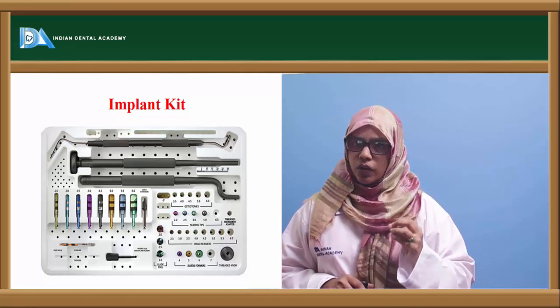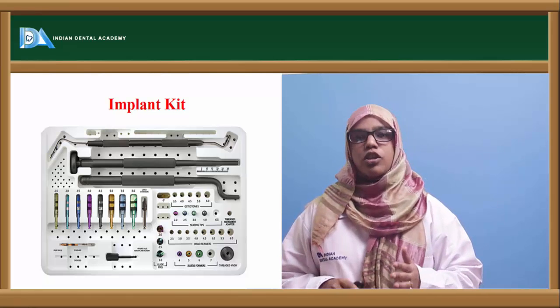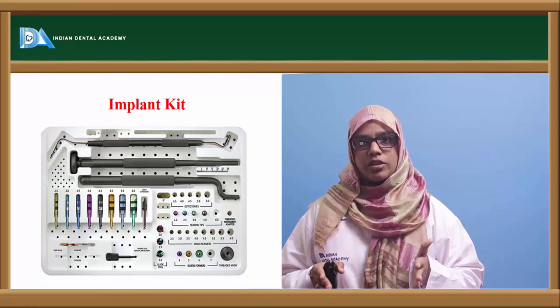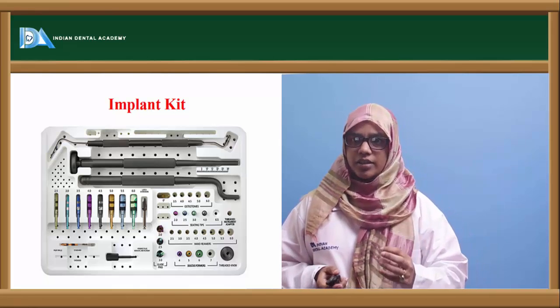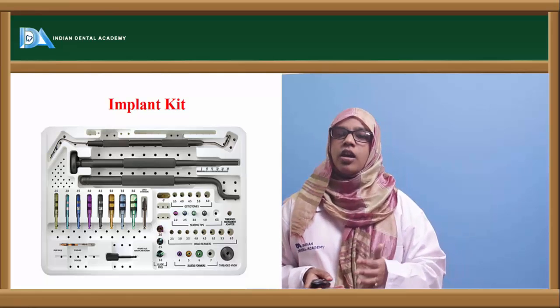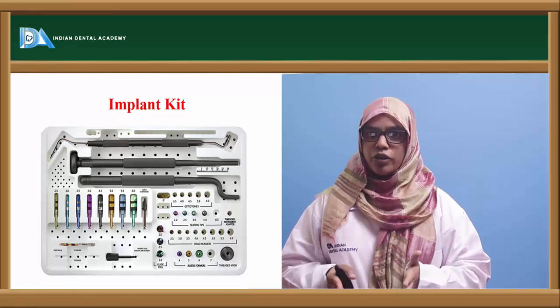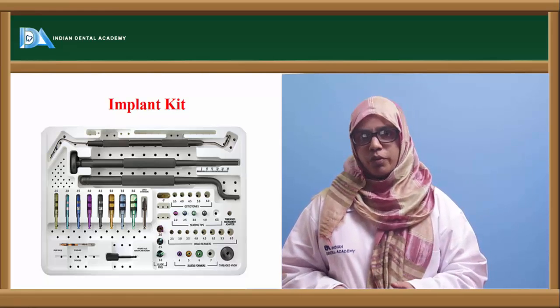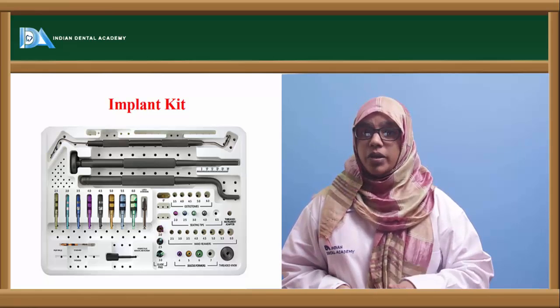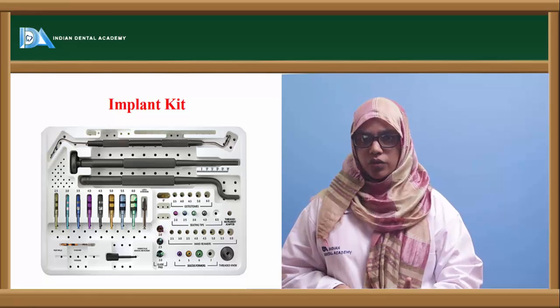So once you have got your desired length and checked it with the depth gauge, you sequentially enlarge the size using wider diameter drills. Start with the lesser diameter and go up. If you are using a 4.2 mm implant, you will make your osteotomy around 3.8 to 4 mm. That also depends upon the density of the bone. If the bone is very dense, you will make a 4 mm osteotomy.